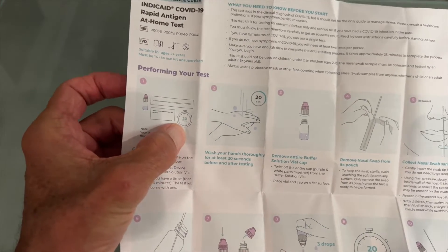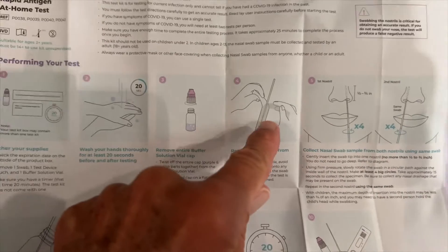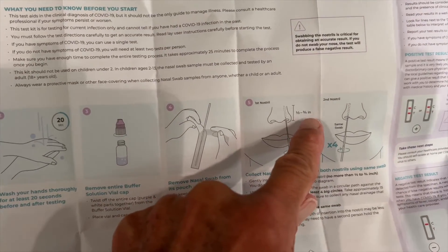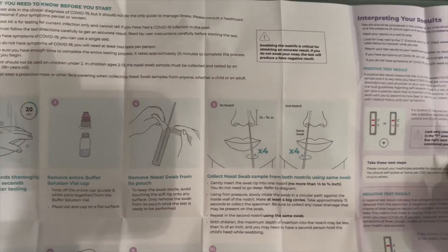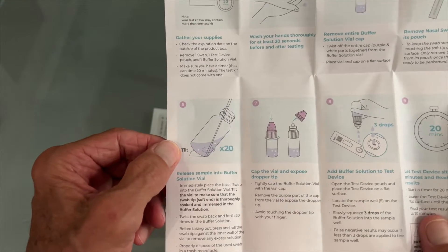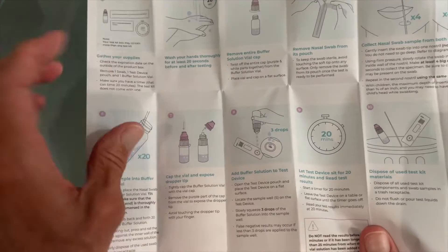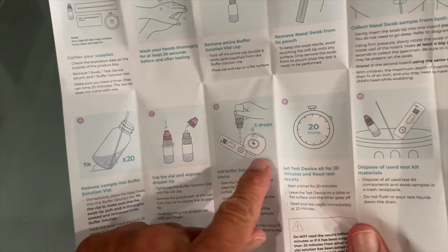So what they say first is: pull everything out, wash your hands, unscrew your cap, unhook your thing, shove it up your nose half to three-quarters of an inch, do four swirls on both sides. Then you stick it in the little tube and smoosh it around 20 times, then put the cap back on.